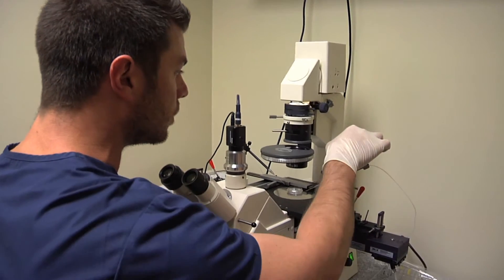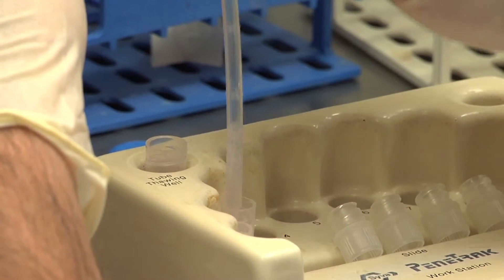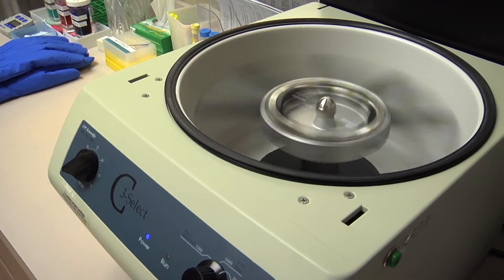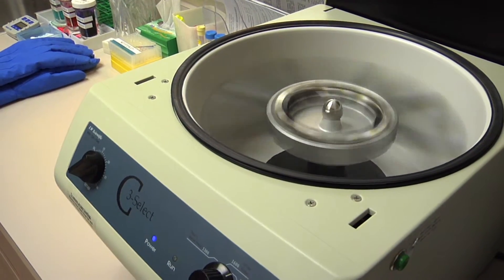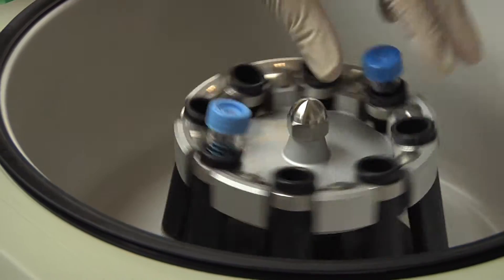From the sperm standpoint, a male would come in and donate a specimen typically here in our facility, or they can do it at home and bring it in. Once we have the specimen, it will typically be treated in various ways to purify it and clear out any impurities, which allows us to move forward and start to freeze the specimen.